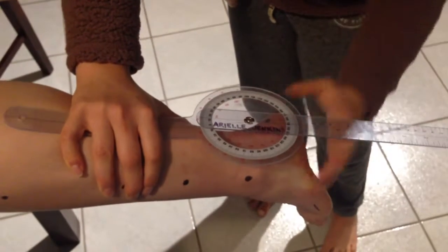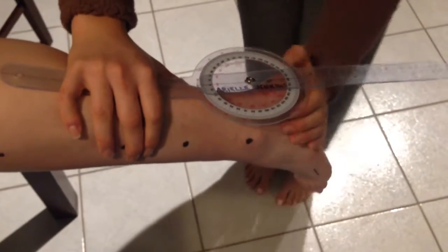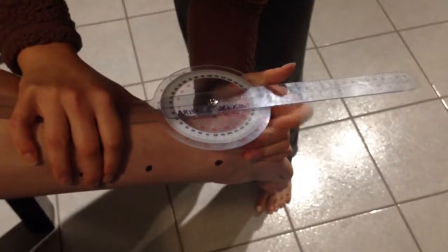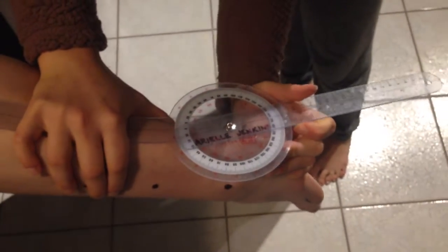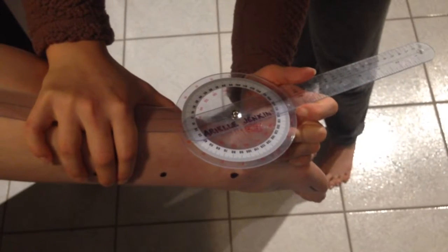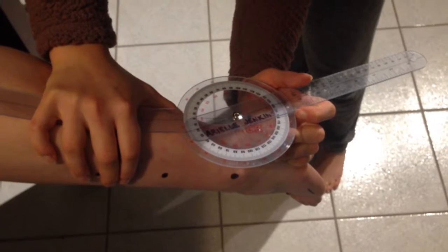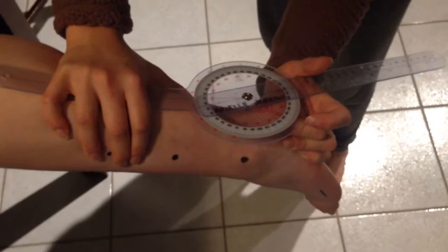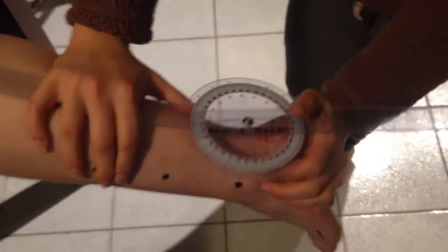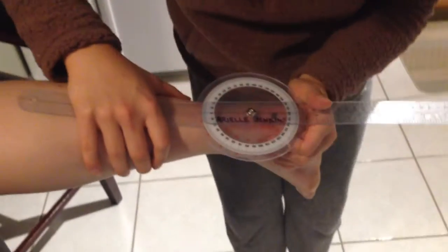Okay, and now I'm going to go back to neutral and I'm going to invert the foot. That looks to be about 20 and is 19, firm tissue stretch and feel. Any pain with that? Nope. Okay. And I'm gonna go on to the next leg using the exact same landmarks.